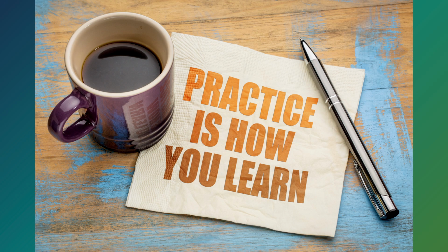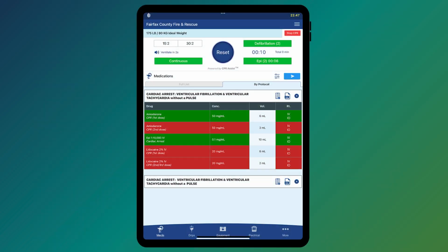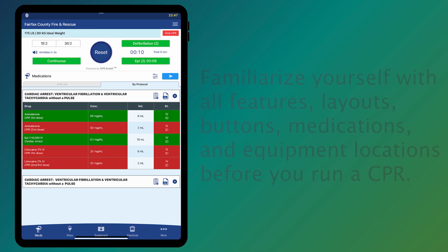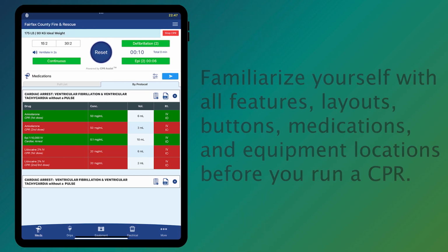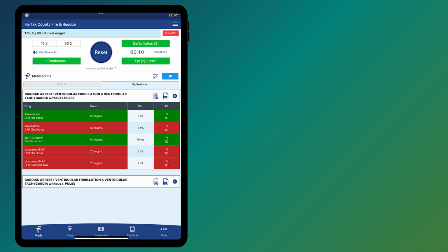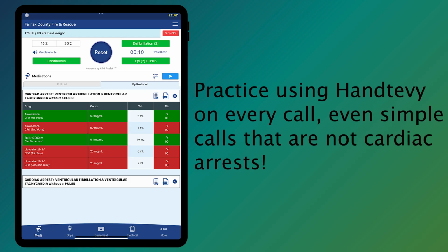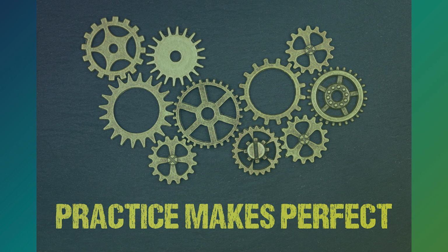Understand that it will take multiple practice sessions with your team to become proficient, especially for crews who have not used CPR Assist during cardiac arrests. It is crucial to familiarize yourself with all the features, layouts, buttons, medications, and equipment locations before you run a CPR. We recommend practicing with your crew at least once a tour. Additionally, practice using the Handtevy app on every call, even for cases that only require one medication or procedure, such as an IV. The more you practice with it, the more comfortable you will become.